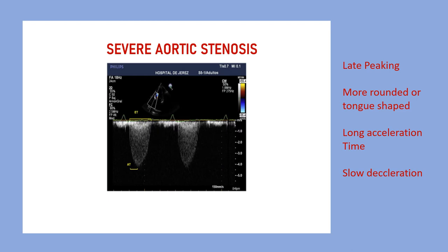In severe aortic stenosis, the signal shows late peak velocity, with a much larger acceleration time compared to mild aortic stenosis. The shape of the signal is tongue-like with a rounded apex, and combined with slow deceleration, this gives a more rounded and tongue-shaped appearance to the aortic valve continuous wave Doppler signal.